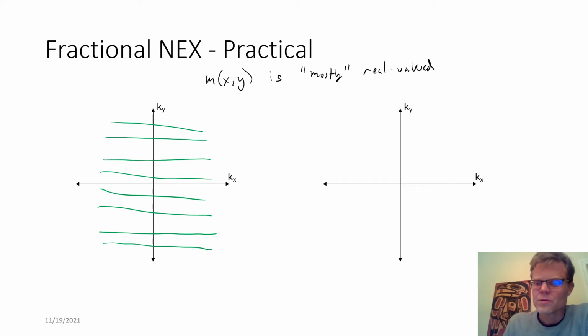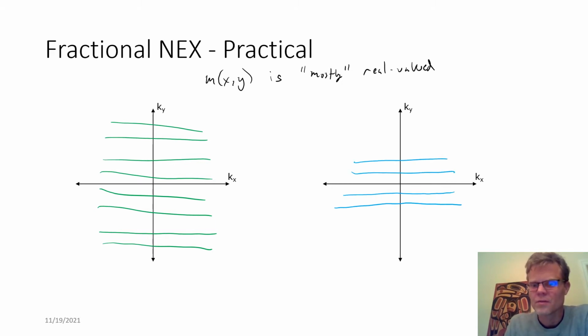And so what we do in this case is some fractional NEX or partial Fourier where we do some overscanning, covering a little bit extra of the center region of k-space, so not quite a half NEX.